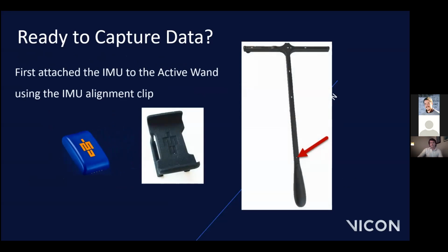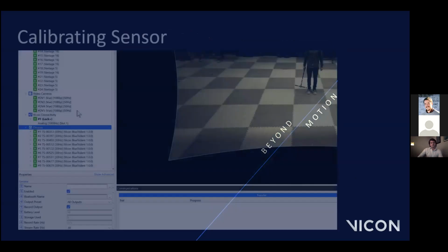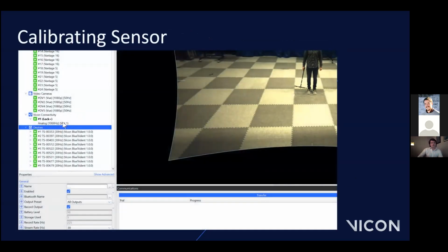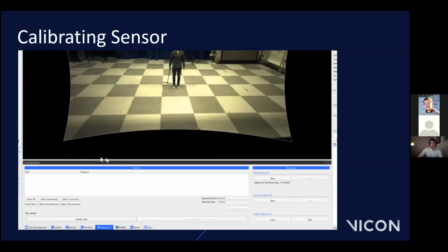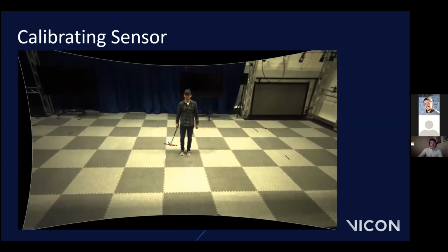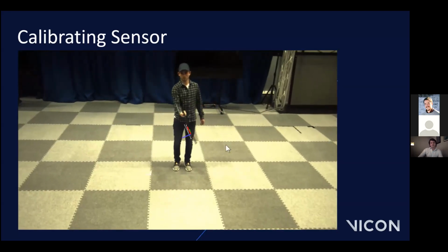To do this, we first attach the IMU to the active wand using an IMU alignment clip, like so. You then select the sensor that you've just attached to your wand, and go to the IMU tab, where you will find the alignment section. Under World Alignment, click Start, and you should notice that the active wand is now being tracked. The sensor can be calibrated by waving the wand in a figure of 8 pattern for approximately 10 seconds before clicking Stop.